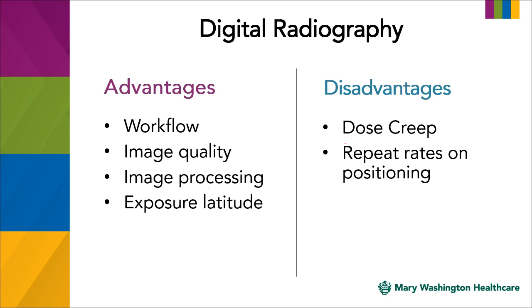Image processing: we have pre-processing and post-processing, which we'll get into talking about both of those. And so those are major advantages.